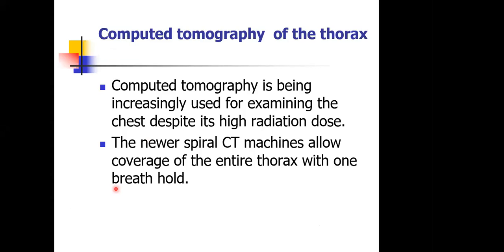Away from that now takes me to computed tomography. This is the modality that falls only second after chest radiography when it comes to evaluating chest pathologies. It's more or less like the next resort, and it tends to solve most of our problems. So it is increasingly being used for examining the chest, the only drawback being the high radiation dose that is associated with it.